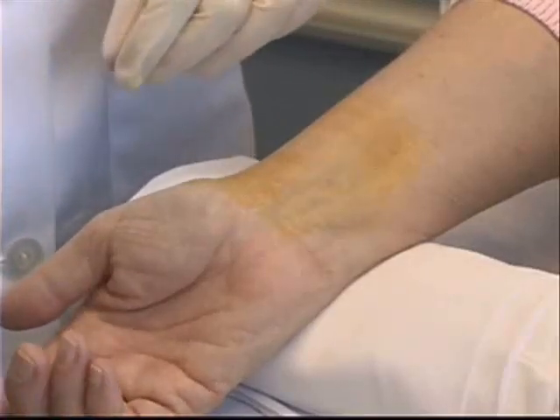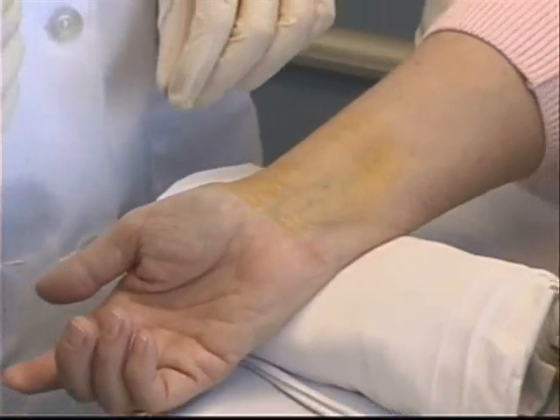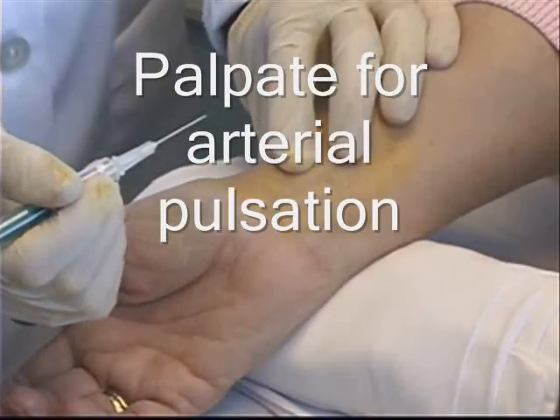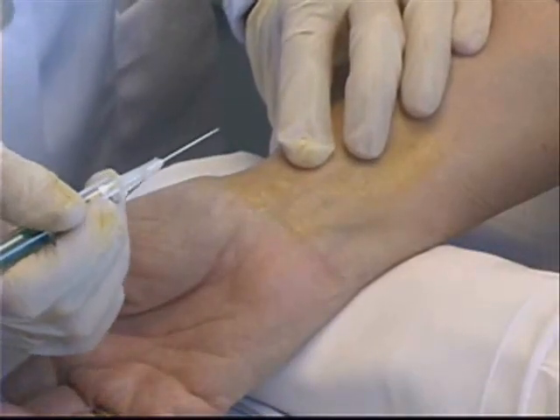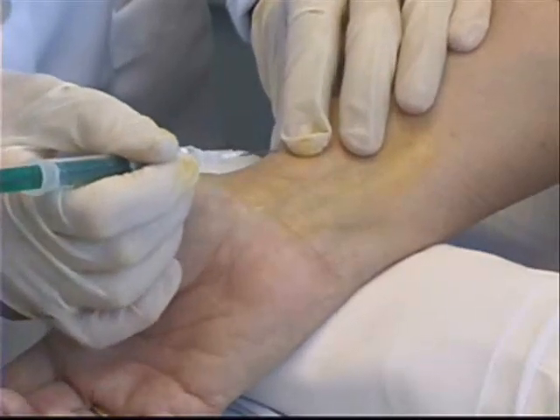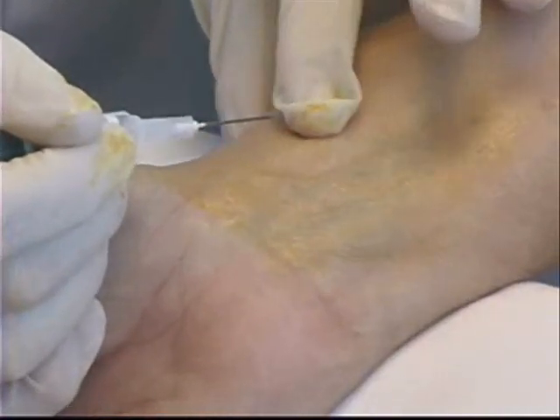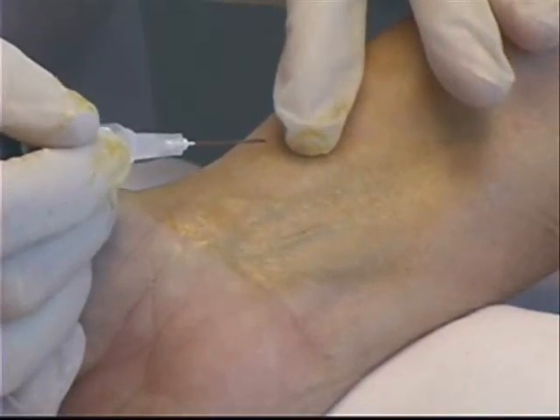I'm going to hold the syringe differently for the blood gas procedure — at a sharper angle, closer to 45 degrees, holding it much like a dart or a pen. I'm going to feel for that pulse, as that's my only landmark for where I'll break the skin. I have my needle right there, ready to go in, and the last thing I do before going through the skin is roll my finger back a little bit out of the way.